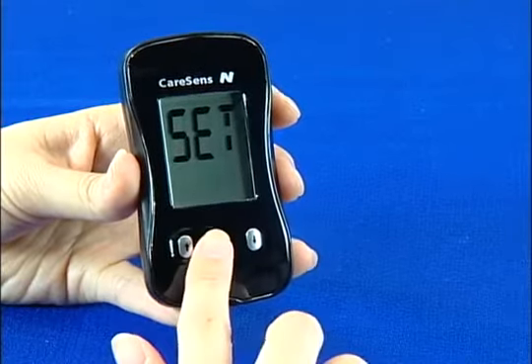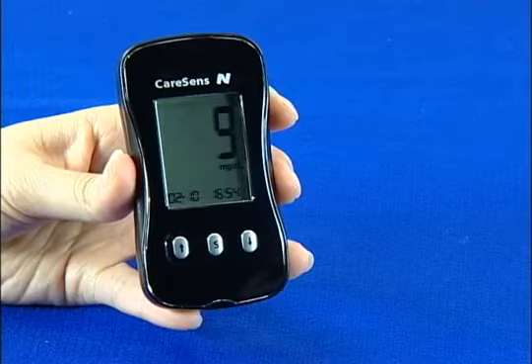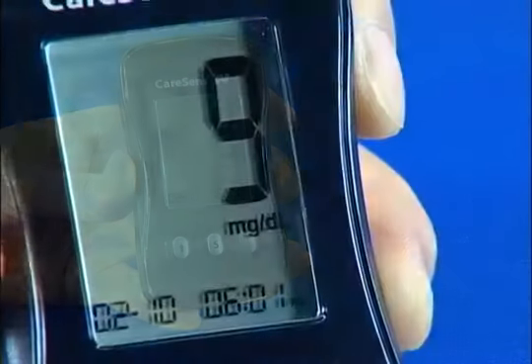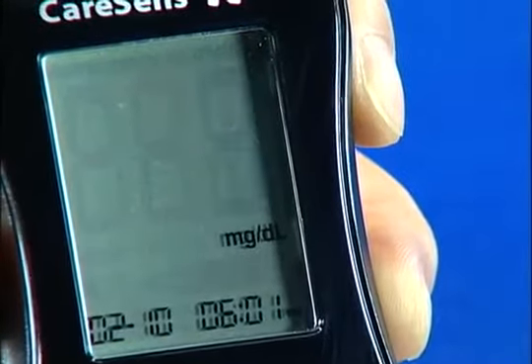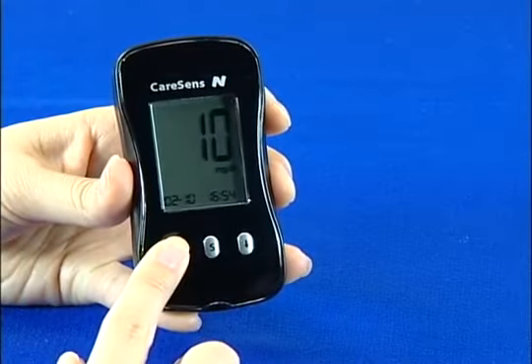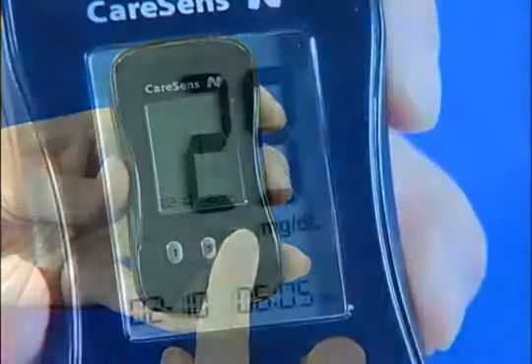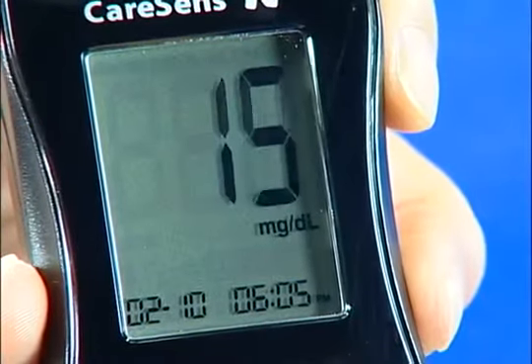Pressing the S button again will let you set the year. The blinking number represents the year. It can be changed up to year 2030 using the arrow buttons on the left or right. Pushing and holding the right button lets you quickly scroll through the numbers.